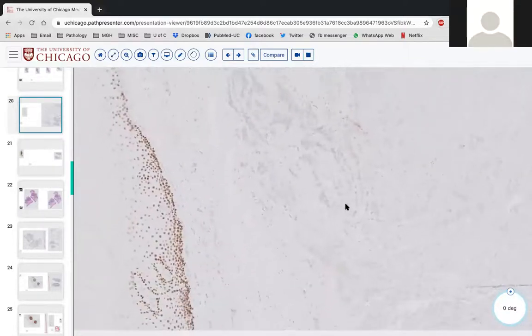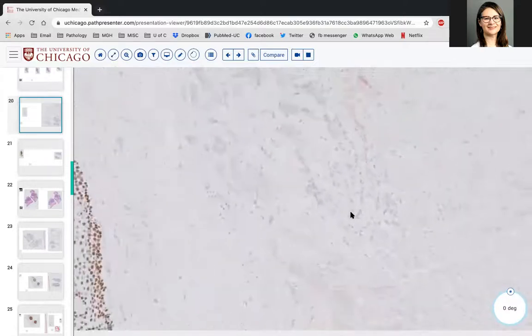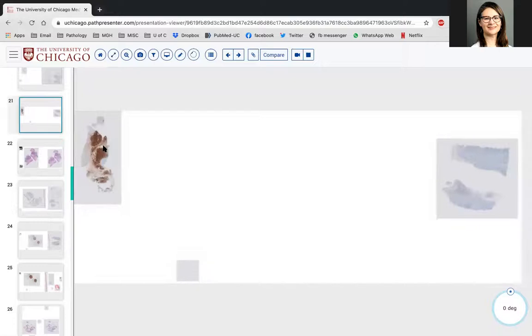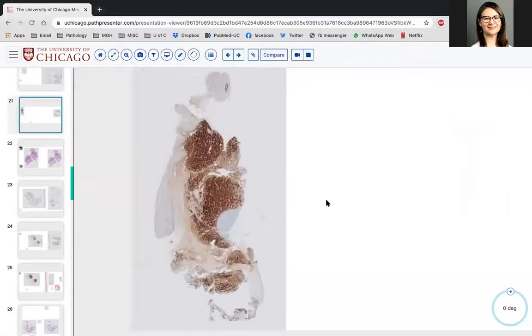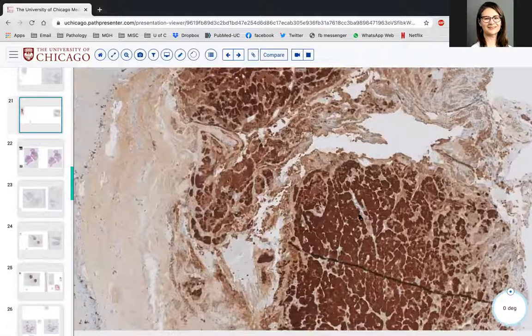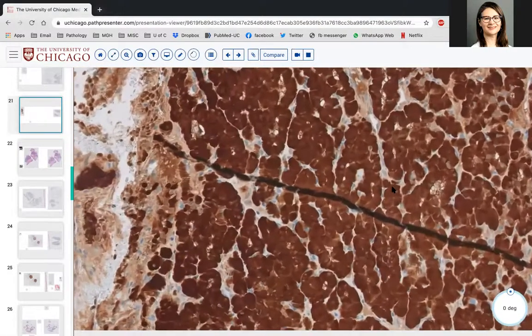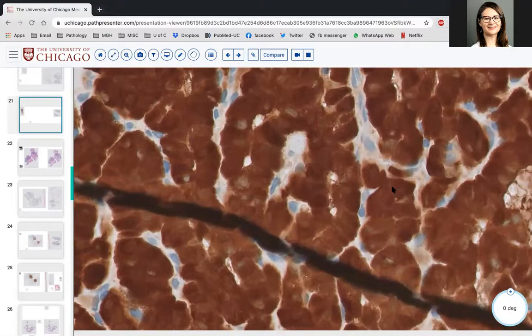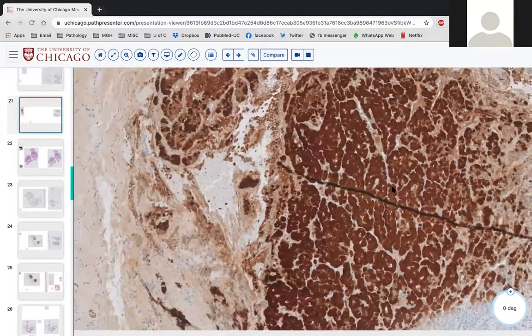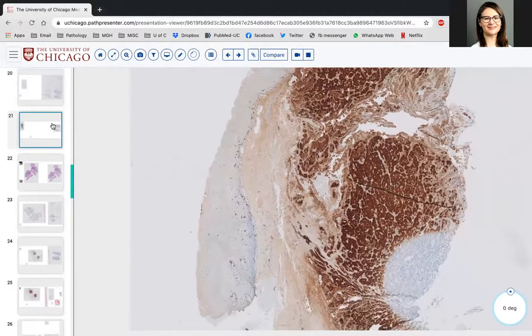Ooh, some people are typing some options in the comments. So if you are lost, but you have this diffuse strong S100, think about that table of diffusely strongly S100 positive tumors. And I see Ryan and Perry and Heather all saying polymorphous, PAC. Oh yeah. Okay, cool. Thank you guys. So Perry, tell us why polymorphous.